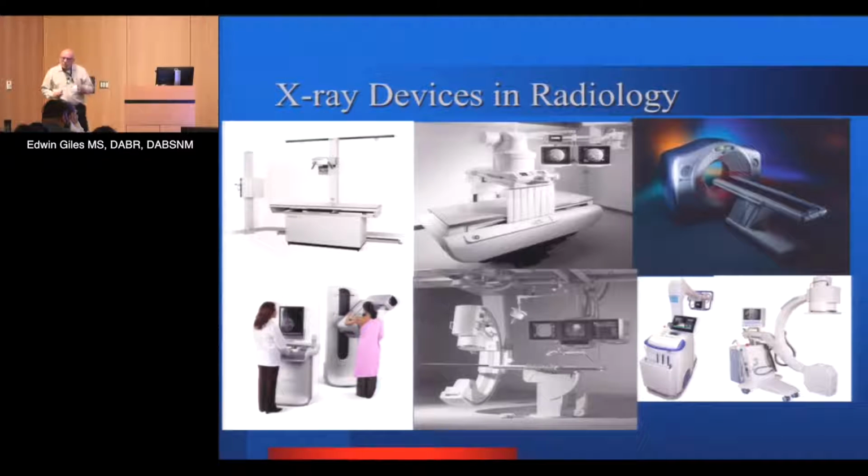A couple points. Radiographic imaging is an almost instantaneous image, right? So if you go in, they need to see if I have a broken arm. Quick shot, it literally lasts milliseconds. When you are in the OR environment, when you're using portable C-arms or some sort of interventional suite, when we're dealing with fluoro or fluoroscopy, we step on a pedal. And as long as our foot is on that pedal, x-rays are being generated. Unlike radiographic, where it's instantaneous, fluoro can go from now till the end of the day, assuming the tube doesn't blow up from being too hot.